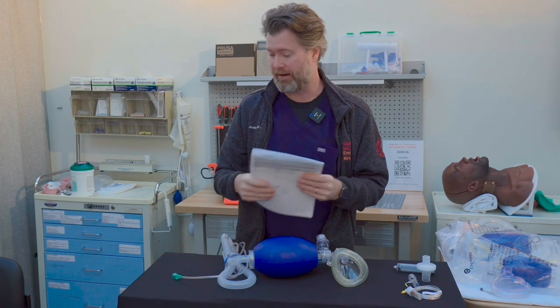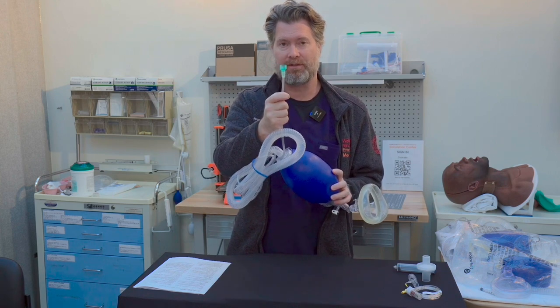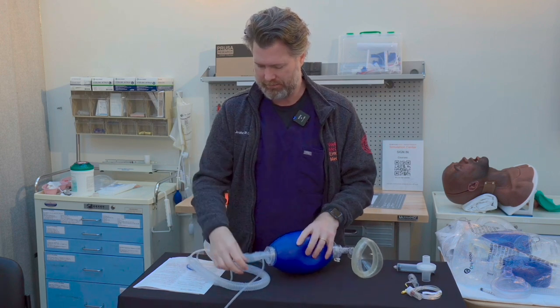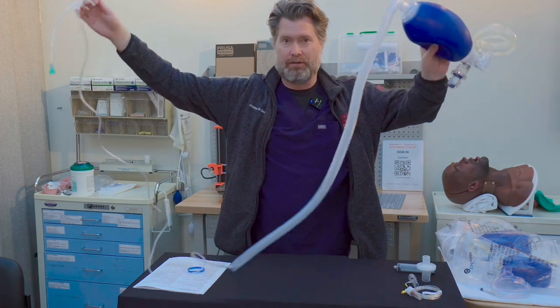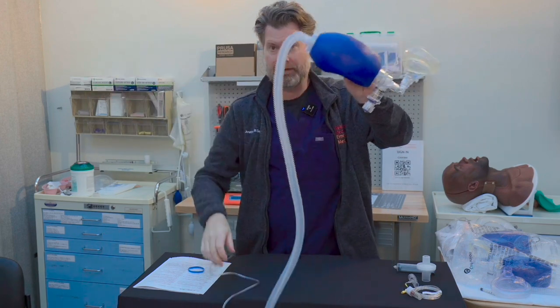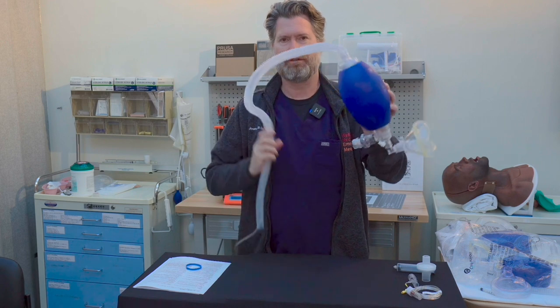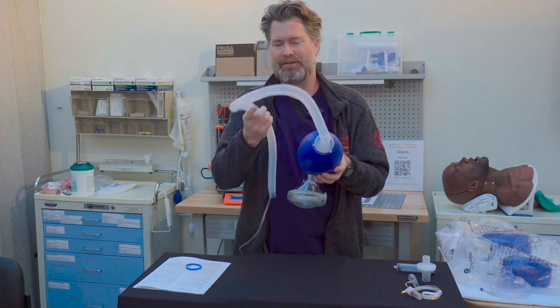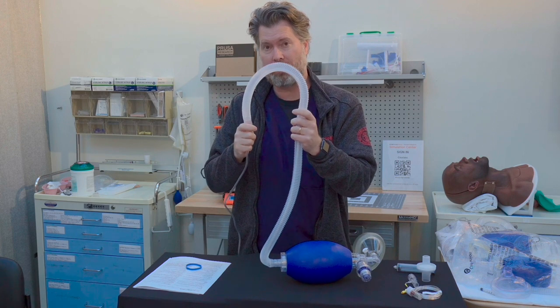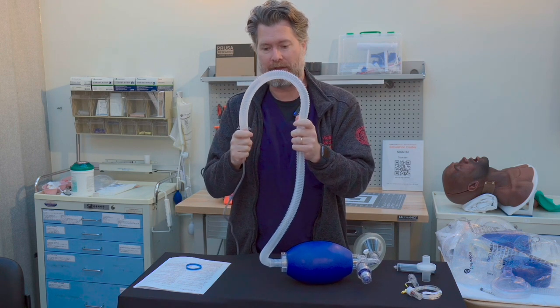Let's go through it from end to end, starting here at the very end — this is what attaches to the Christmas tree, so this attaches to your oxygen. You'll see it has a fairly long hose, which gives you a fair amount of room to plug it all the way into the wall and still reach your patient. As you get down here, you'll notice this structure. At first glance you may think it's just a protective covering, but in fact this is the oxygen reservoir — and this is one part of the design that helps you deliver close to 100% FiO2 to your patient. This ends up being one of the reservoirs.